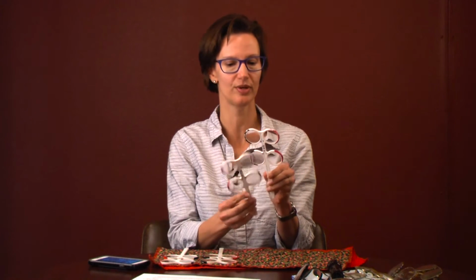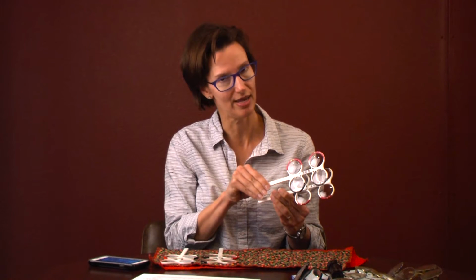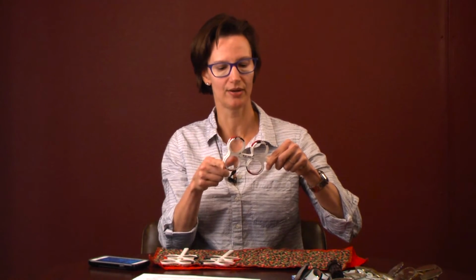And we're going to add the 4.25s with the 3 opposite colors. So then you've got the black positive 4.25 lying over the negative red 3. That creates positive 1.25 on one side of the lens and a negative 1.25 on the other side of the flippers. So you're going to start with this and you're going to ask them, if they can't see distance, which side looks better, the plus 1.25 or the negative 1.25.